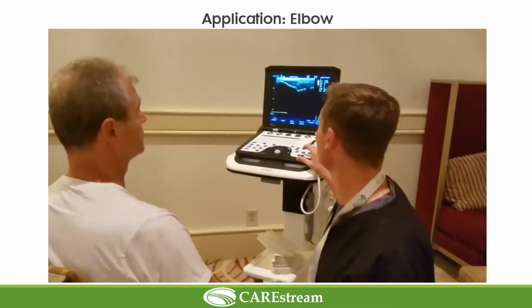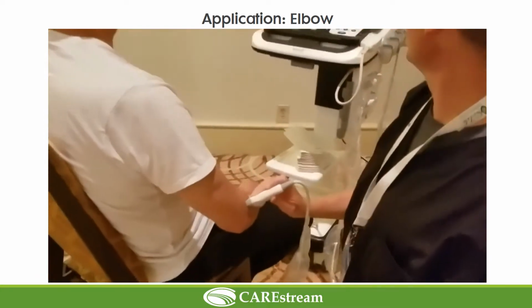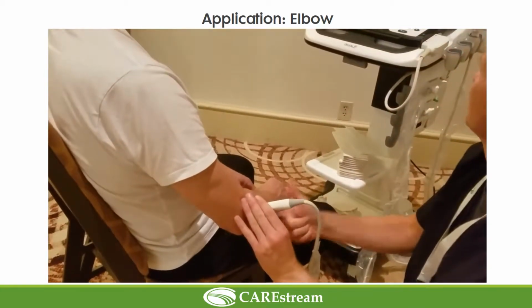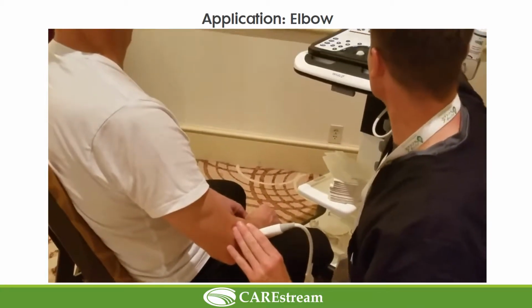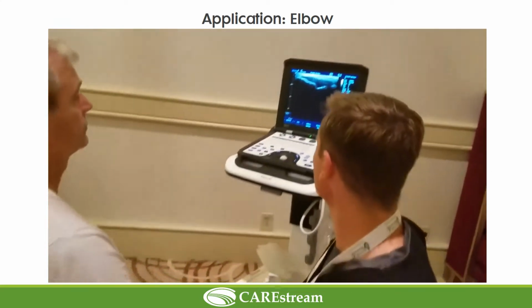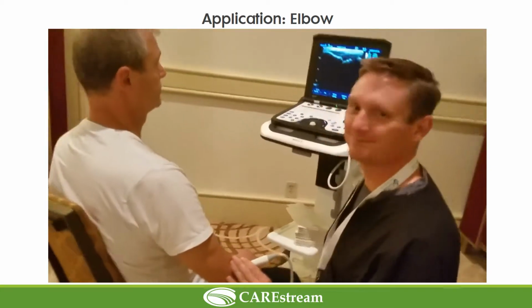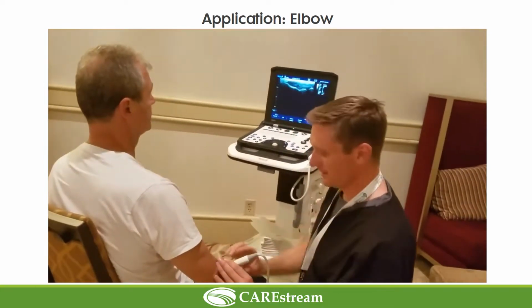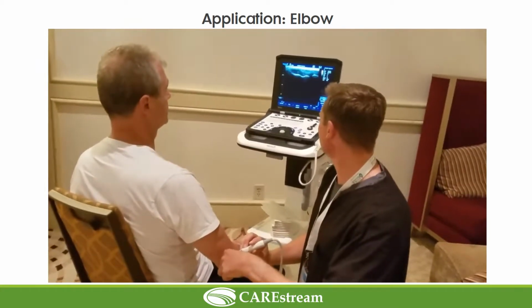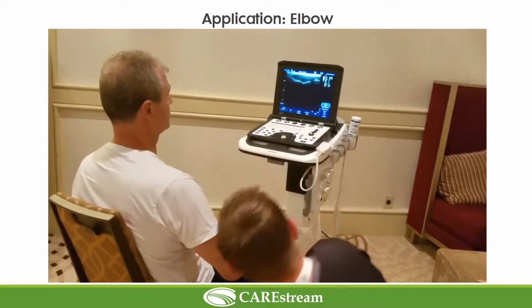Okay. So the injection for the lateral epicondyle, there's many ways to do it. You can do it the classic way, where you guide the needle from distal to proximal along the top of the epicondyle and inject. Okay. Now, because you have an ultrasound and you can see it, why not make your life easier? So going all this distance, why don't we come from the back? Inject right underneath the skin, right under the probe, make sure everything lines up again.